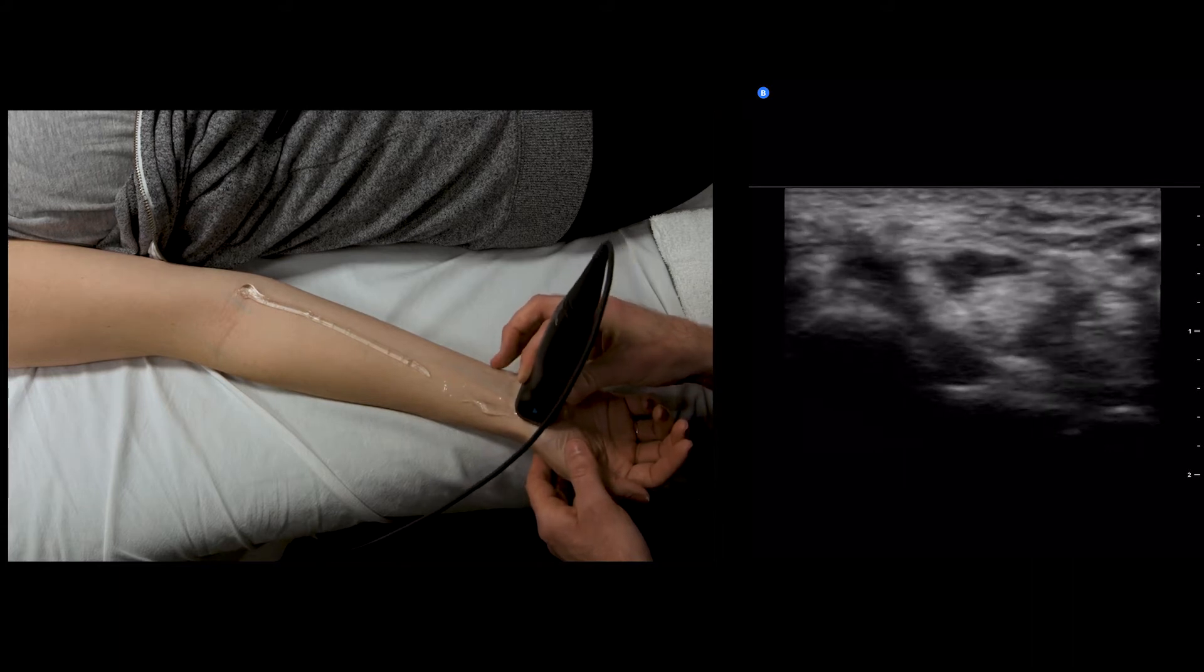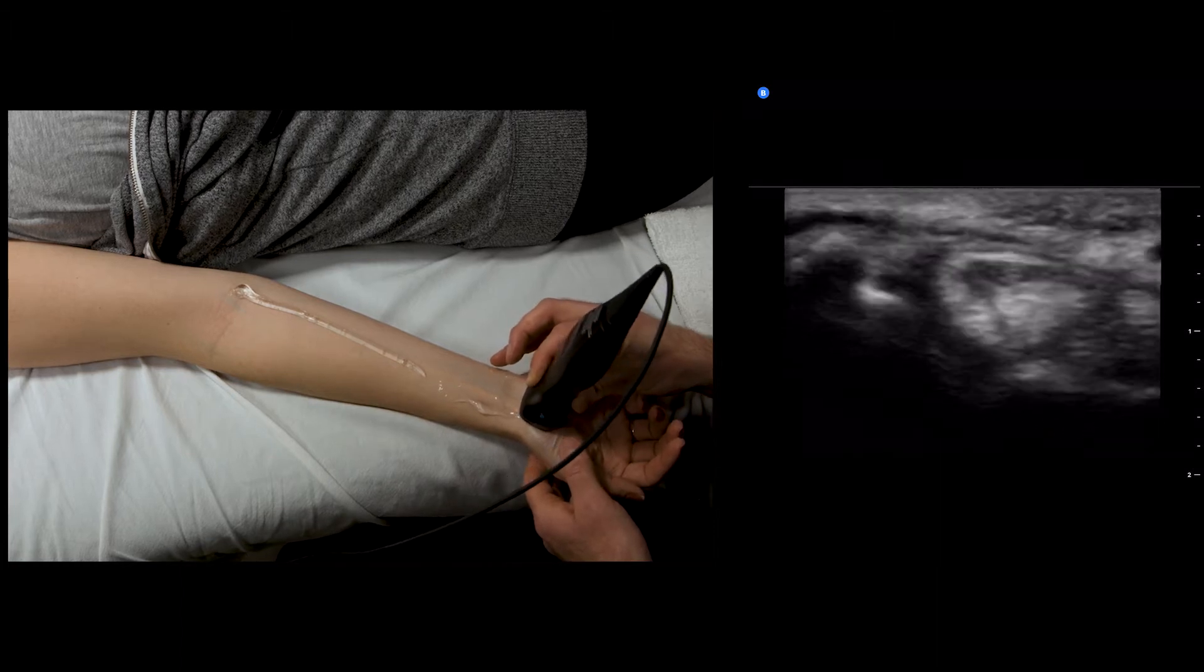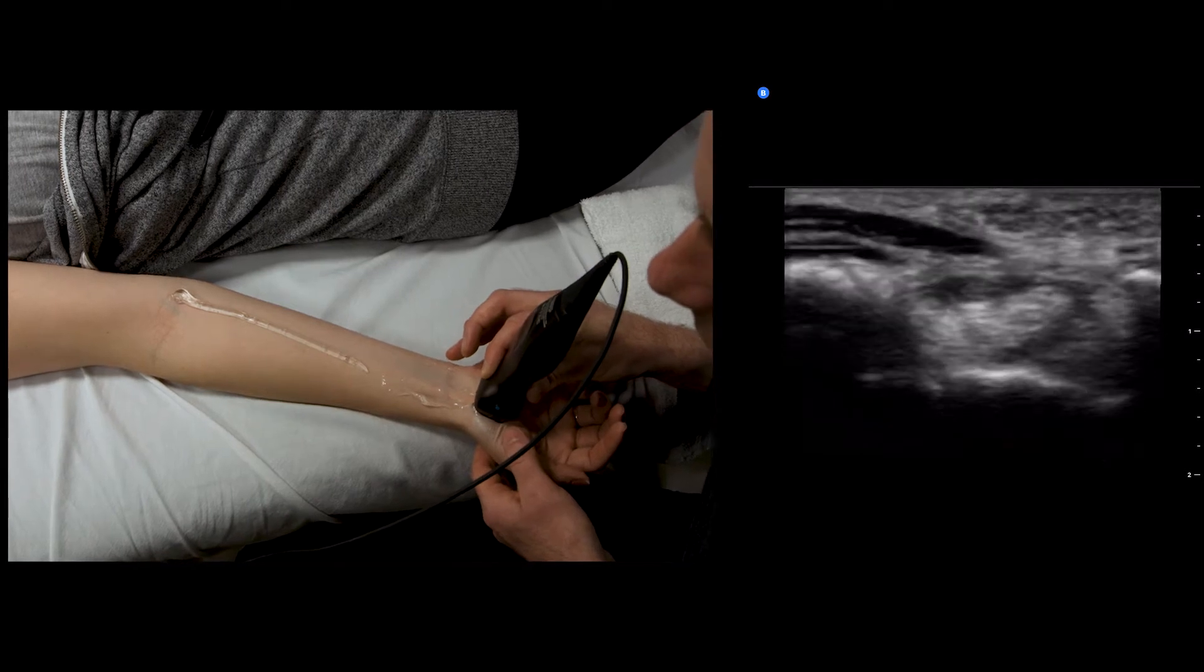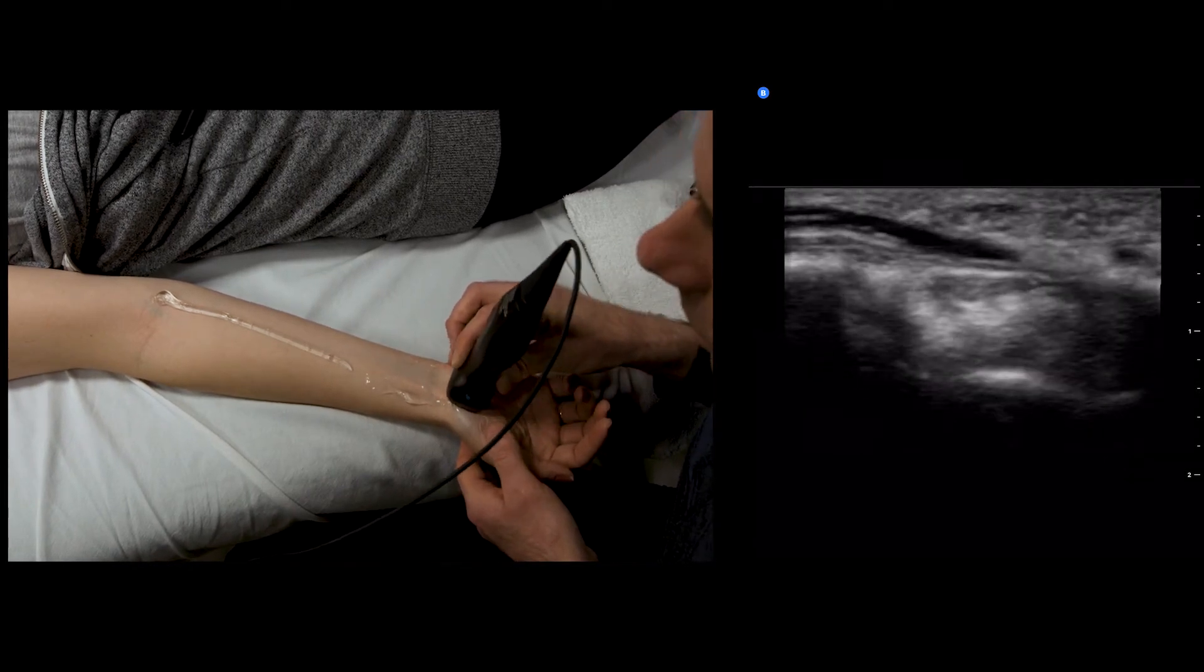When it drops down, we want to wag our transducer to look back up at it. That's going to be the easiest way to see it and make sure that we get good reflections off the nerve itself.